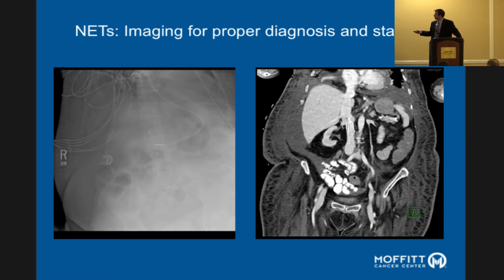The bile ducts are not obstructed. The pancreatic duct is not obstructed. You can see the exact position of any feeding tubes. You can see there's some fluid, or ascites, in the abdomen. There's extensive edema of the subcutaneous soft tissues. They've got a pericardial effusion. It just goes on and on and on.